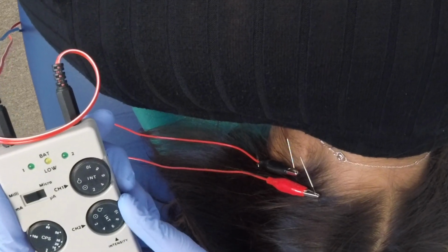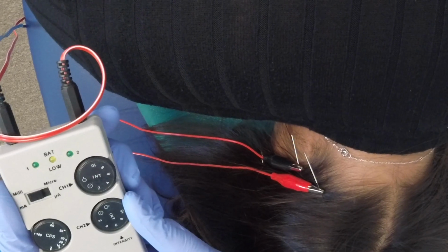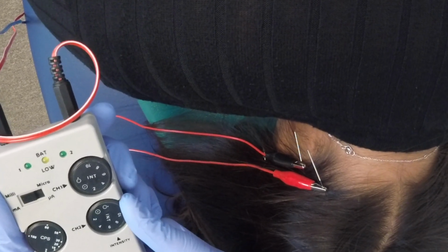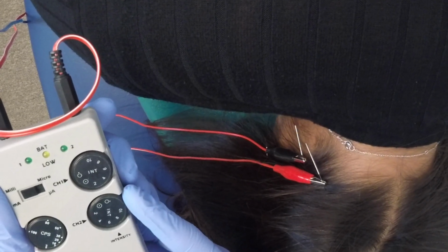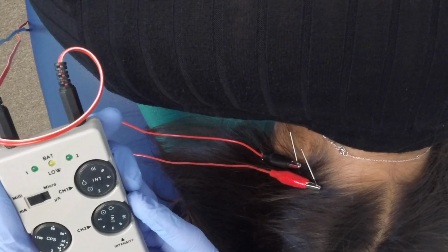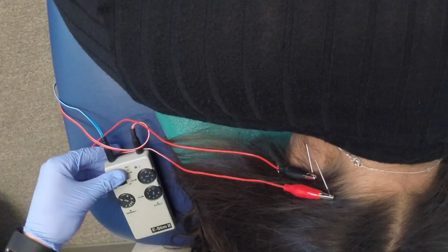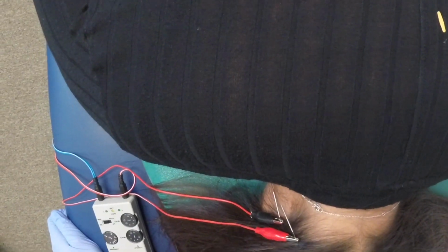So once again, I love dry needling. It's a great technique, and it's really been shown to be powerful at decreasing muscle tension, decreasing tone, improving range of motion, decreasing pain. And so it's a huge part of what we do here in therapy in helping people, like I said earlier though, along with doing exercises and other manual techniques as well. So you can see we've got a nice twitch response going, so we're going to let her enjoy the e-stim and go from there.